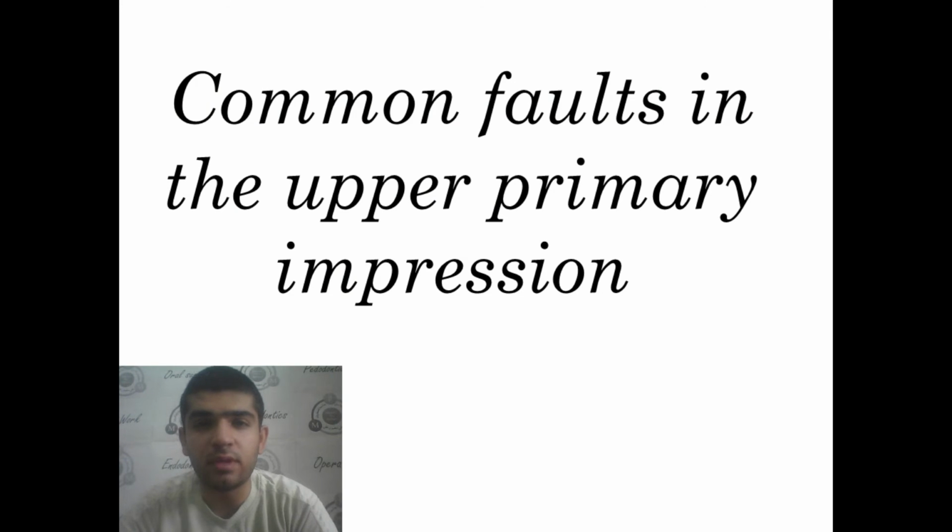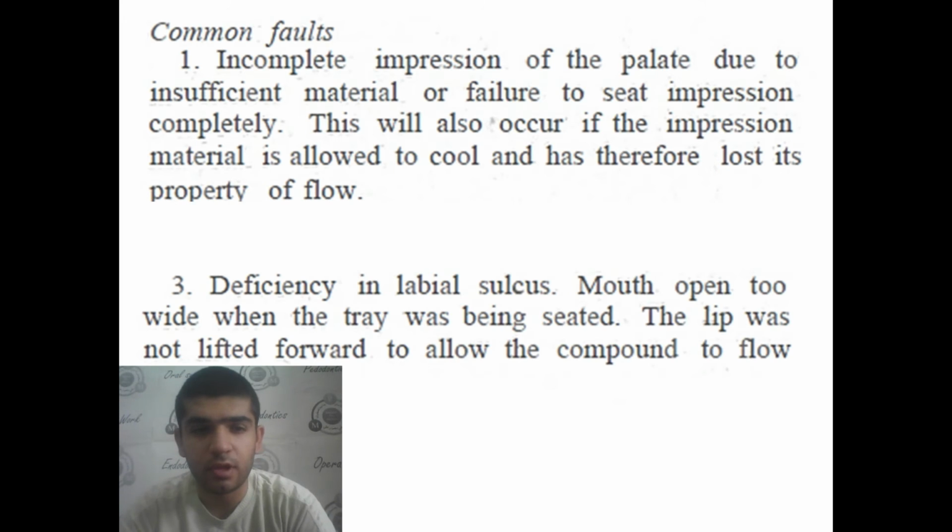Now let's talk about the common faults and errors in the upper primary impression. The first is incomplete impression of the palate due to insufficient materials or failure to seat the impression completely. This will also occur if the impression material is allowed to cool and has therefore lost its property of flow.